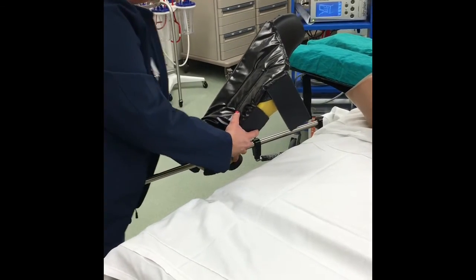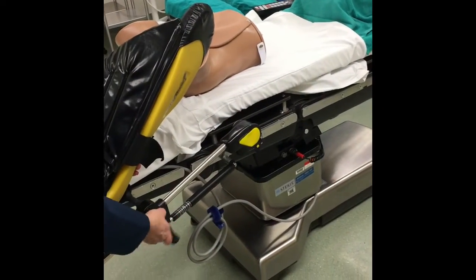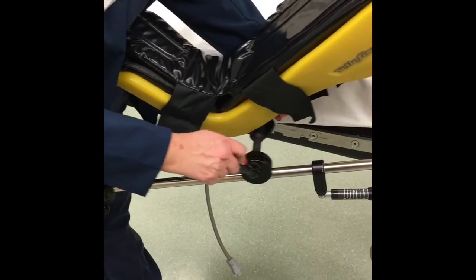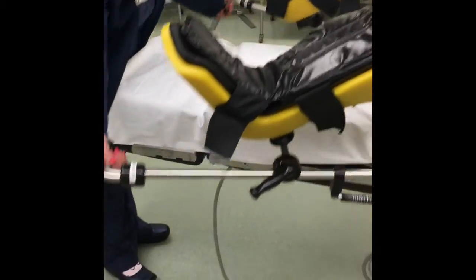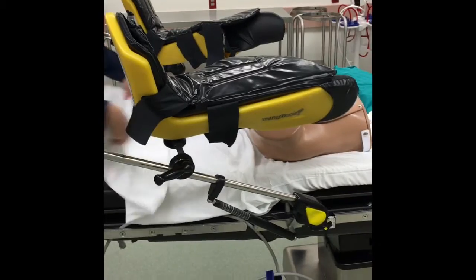So now that we have that in the right spot, I'm also gonna check this one. This one looks pretty good, but it's a little too high. So I'm gonna again move it down. And it just slides like this until you get it in the spot and then lock it. So after you have them up in the stirrups, you would raise them up at the same time and they would be positioned. Then you would remove the end of the bed.